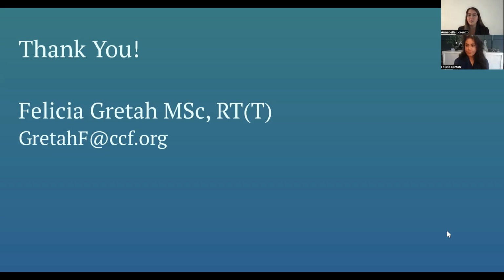What's your experience, Felicia, at Cleveland Clinic? So we began using SDX for our DIBH breast patients, but this was early on and we just did not have a solid process yet. The number of breast patients that we were doing was just too great. So for our breast now, we use a surface guided system, but the reason we're still using this for SBRT treatments is because measuring the actual lung volume is much more consistent and accurate than measuring just the chest rise that you would get with surface guided. So we are exclusively using it for our SBRT patients.